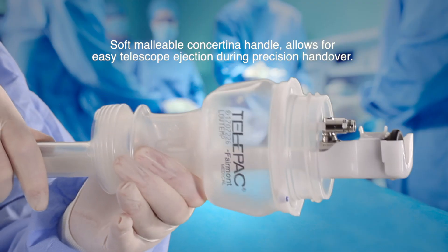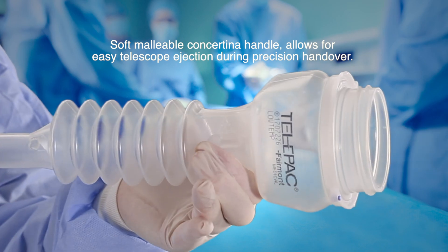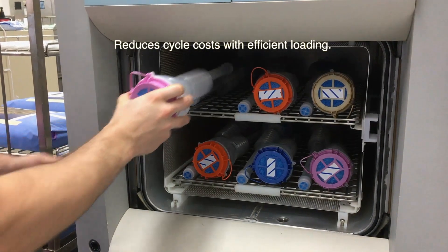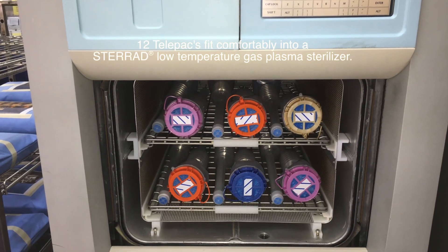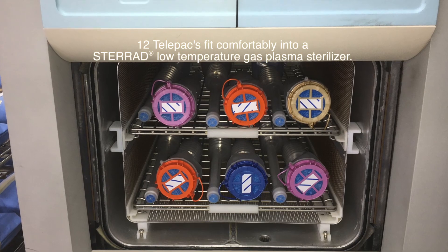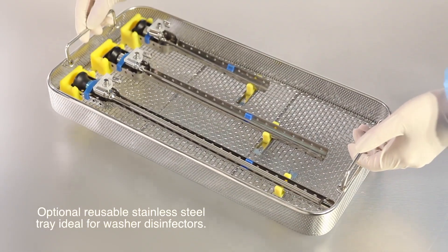Soft, malleable concertina handle allows for easy telescope ejection during precision handover. Reduces cycle costs with efficient loading. Twelve Telepacs fit comfortably into a STERRAD low-temperature gas plasma steriliser.